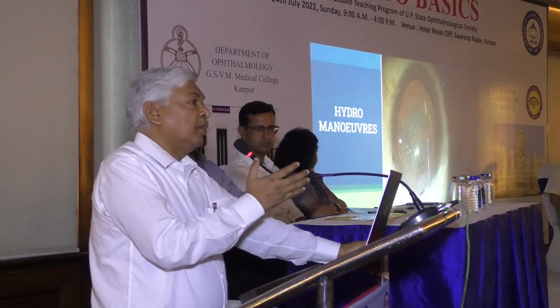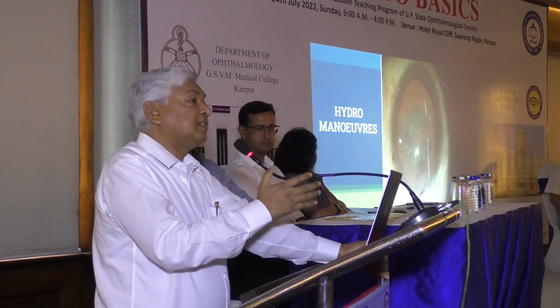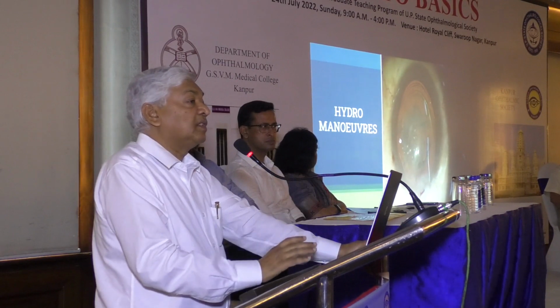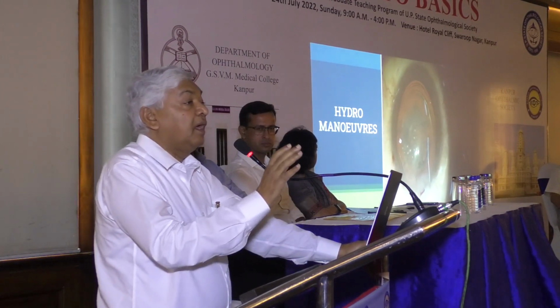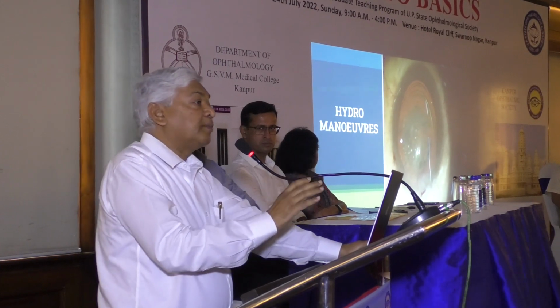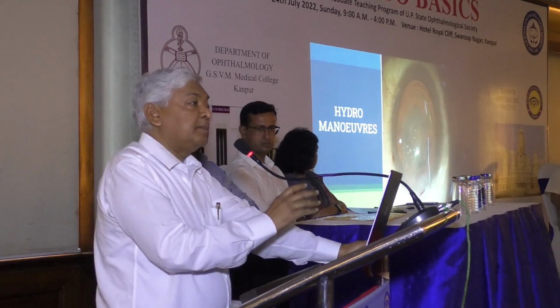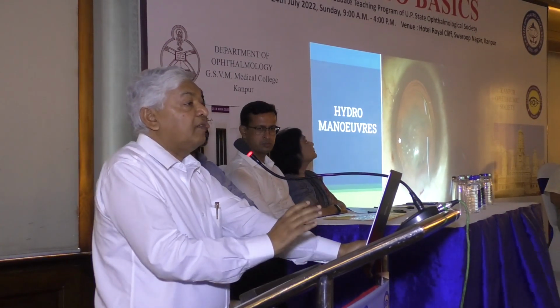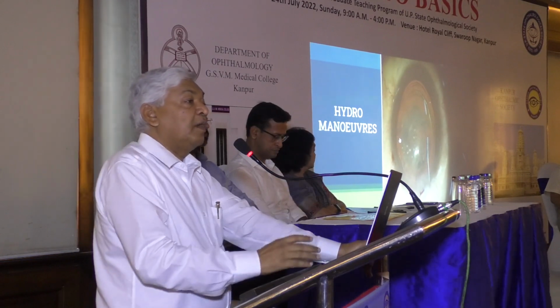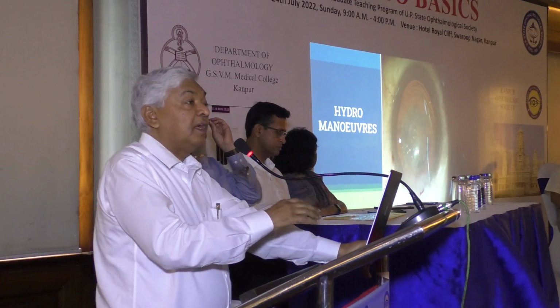The epinucleus makes a cushion for the phacoemulsification, so it prevents PCR during phacoemulsification. And if you do the proper hydrodissection, separating the cortex from the capsule, you can wash and clean the cortex very well, very easily, without much time. And it will remove all the fibers at the equator. So this procedure will also prevent PCO.